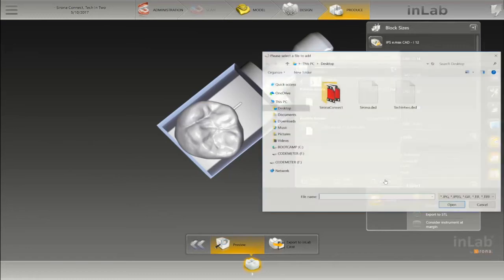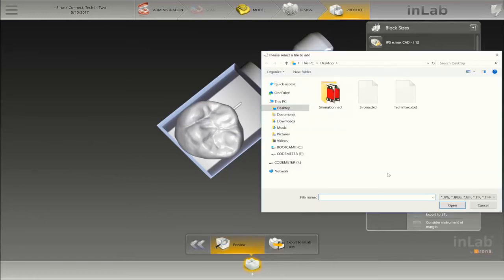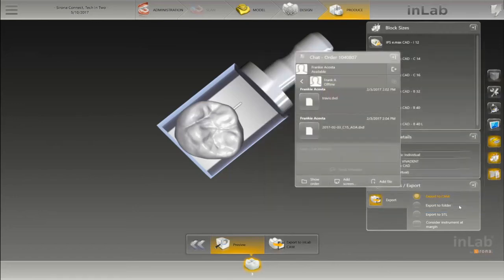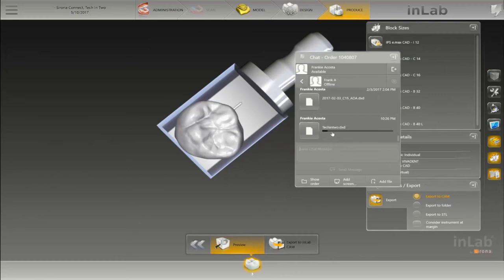Go down where it says add file, find your DXD, and open it. It will upload in the background, usually depending on your internet speed, it can take up to a minute or so.